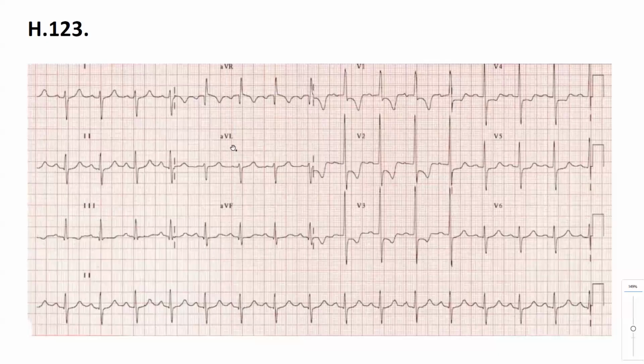And lead 3 looked a bit different. But lead 3, you are looking at lead 2, and whether it's tall or bumpy, that's it. Okay, so that's a sinus rhythm. PR interval is consistent and normal length.